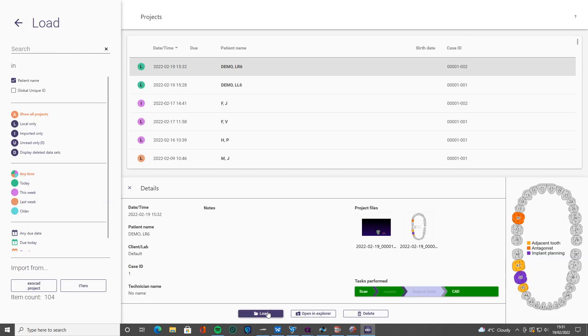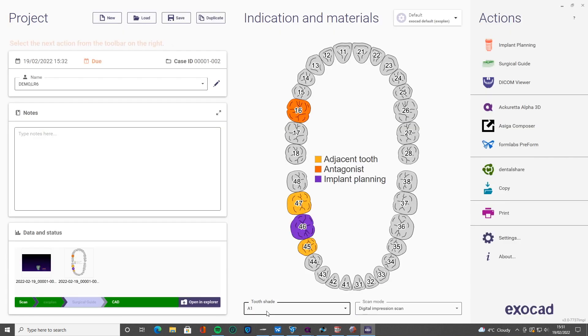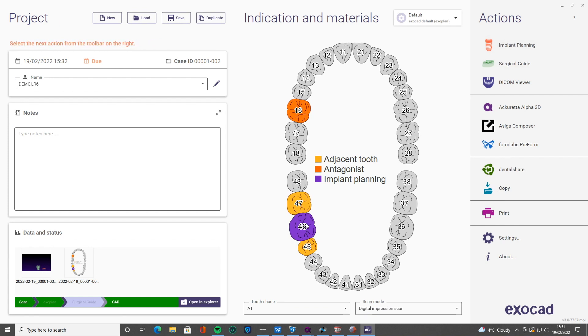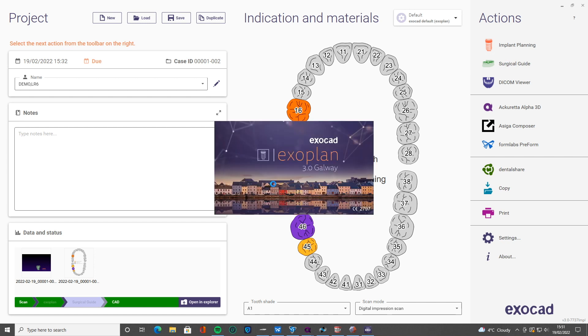Now if you have the guide creator module, then you can go forward with this. We've loaded it back up into Exoplan, so I'm just going to click surgical guide. That highlighted option there we just clicked won't be available if you haven't completed an implant plan.